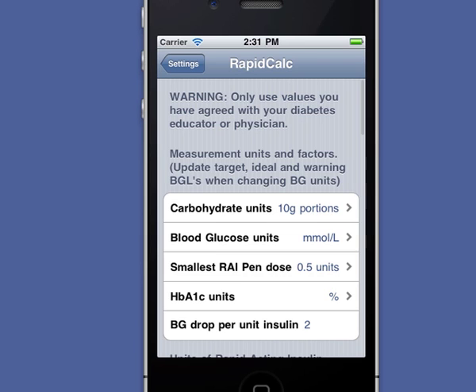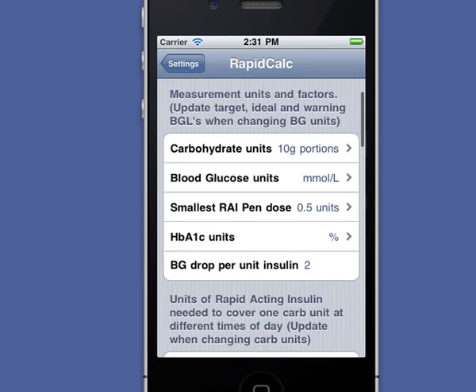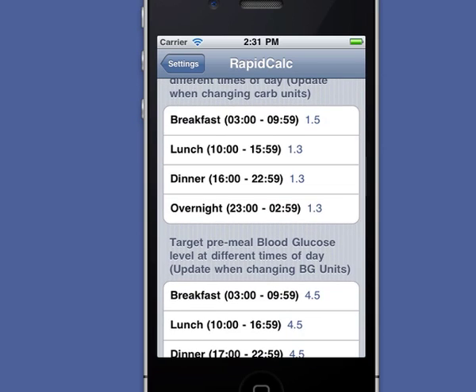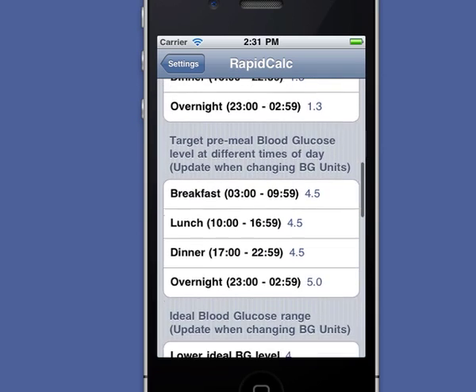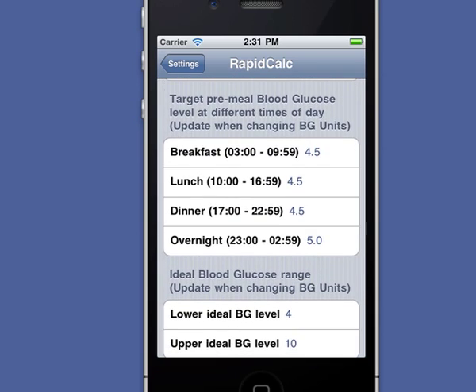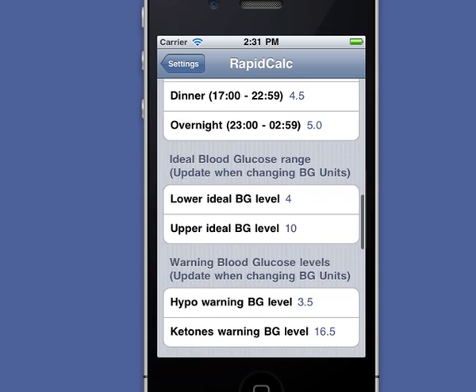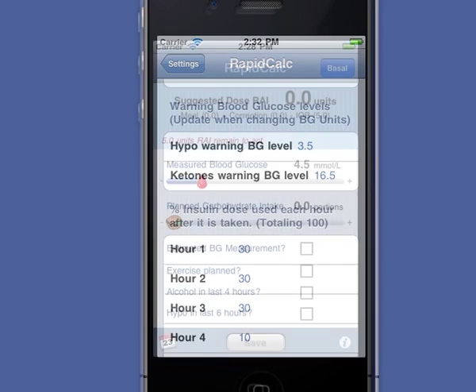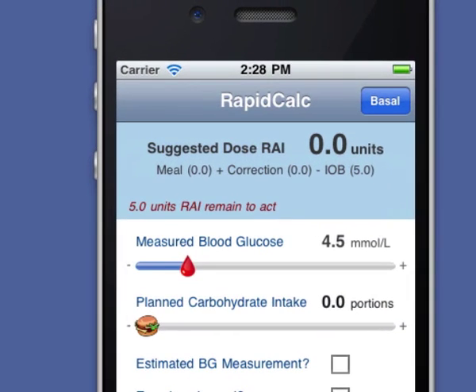RapidCalc knows my correction factor as well as my target blood glucose levels and carb ratios for different times of day. That means it can calculate the appropriate correction and meal doses without me having to think about it. RapidCalc even tracks my insulin on board and factors that in to my dose calculations.